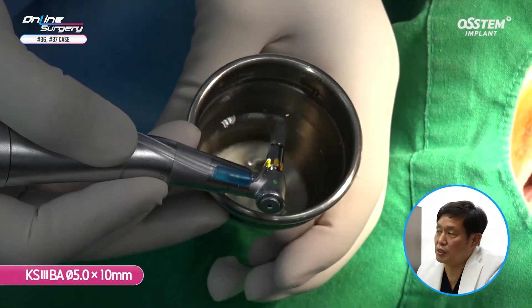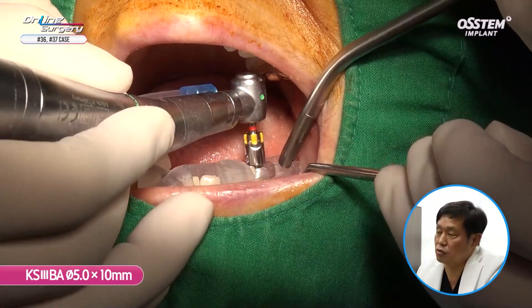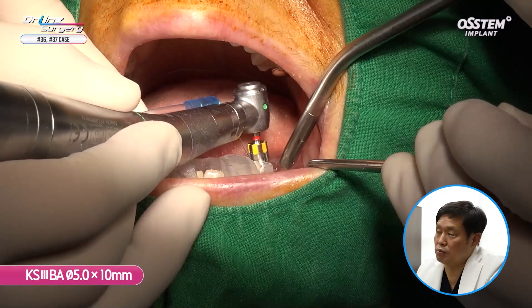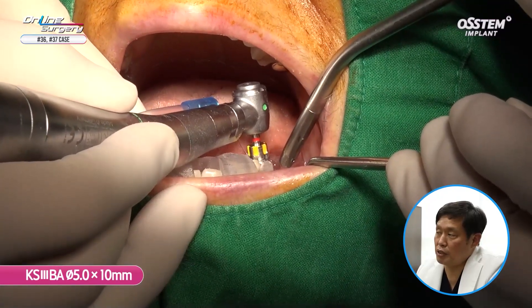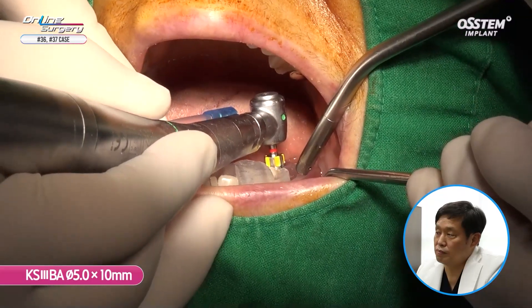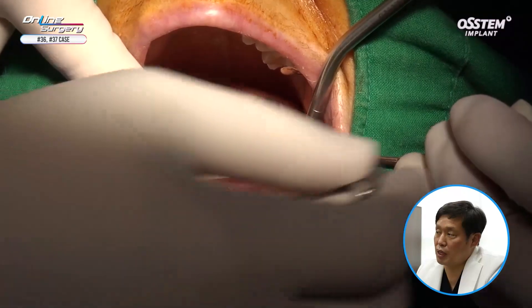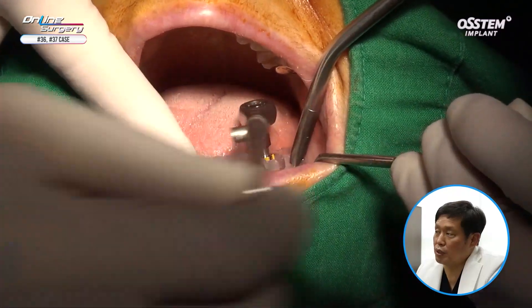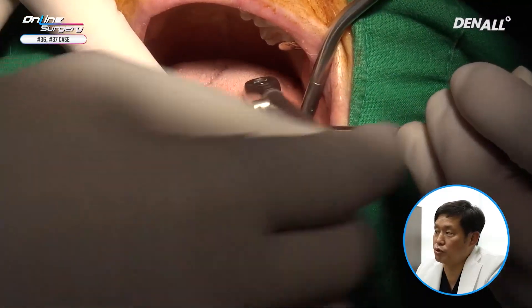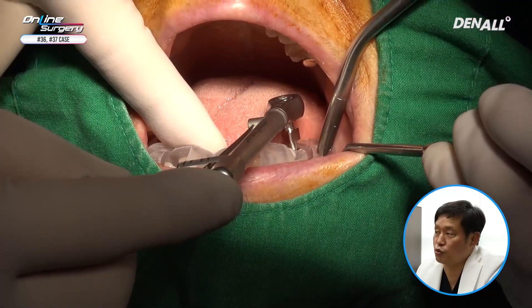BA surface implant. I irrigate sufficiently before placing the implant in its position. Saline is applied. The implant is placed 80% using the engine, then the implant driver is used to position the implant. On the implant driver, you may notice the triangular shape — I am preparing a smart peg right now. In order to get hex position more easily, this is being used experimentally.